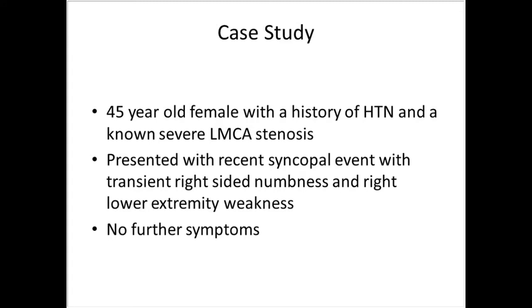So our next case is a 45-year-old female with a history of hypertension and known severe left MCA stenosis. She presented with a recent syncopal event and transient right-sided numbness and right lower extremity weakness. She attributes her symptoms to becoming dehydrated, but then she had no further symptoms.